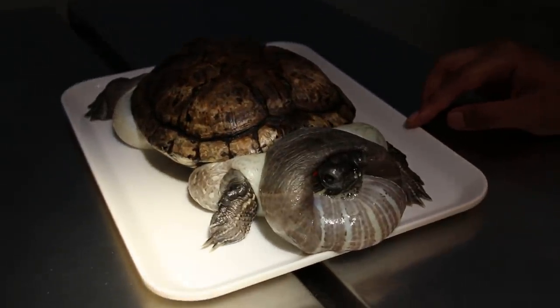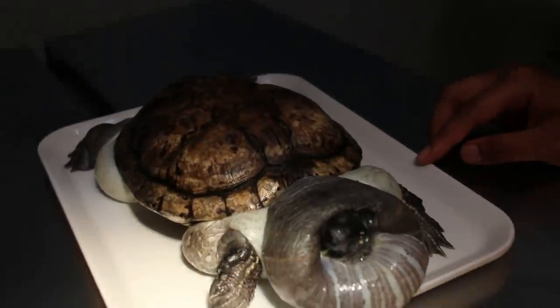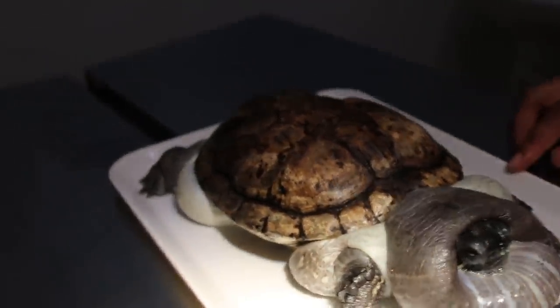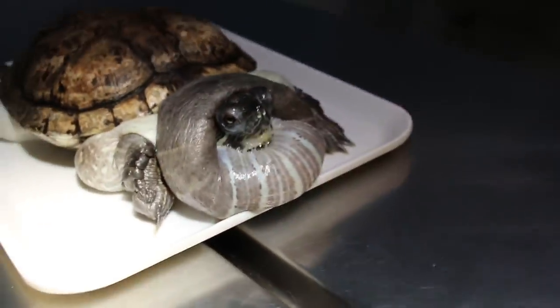Today is November 4th, 2017. This 30-year-old red-eared slider has a big swelling here, as well as the armpit and also the thigh and the legs. The back legs are swollen too. Now we want to aspirate and check for any fluid.